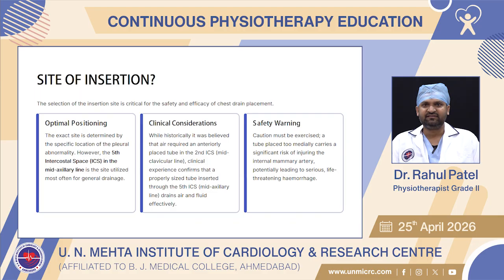Clinical consideration. While historically it was believed that air required an anteriorly placed tube in the second intercostal space, mid-clavicular line, clinical experience confirmed that a properly sized tube inserted through the fifth intercostal space, mid-axillary line, drains air and fluid effectively.